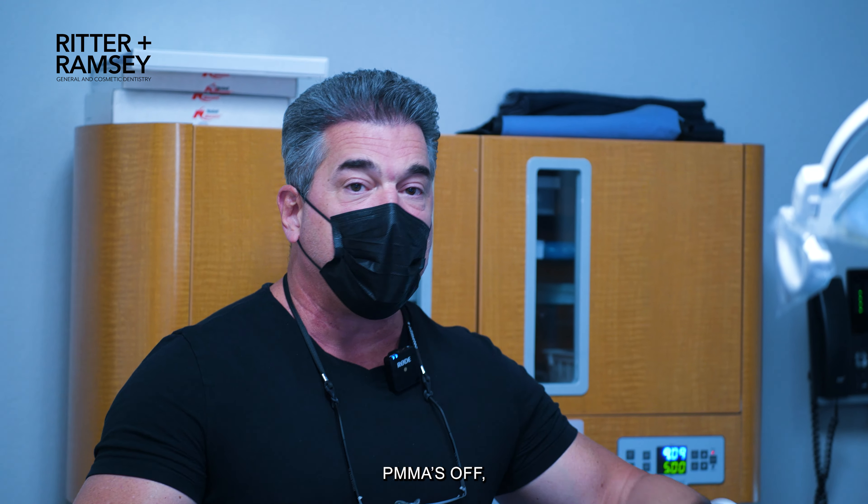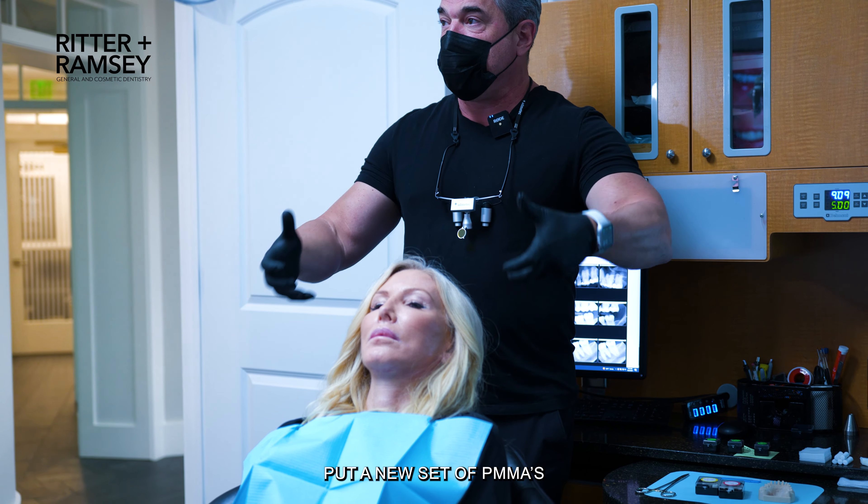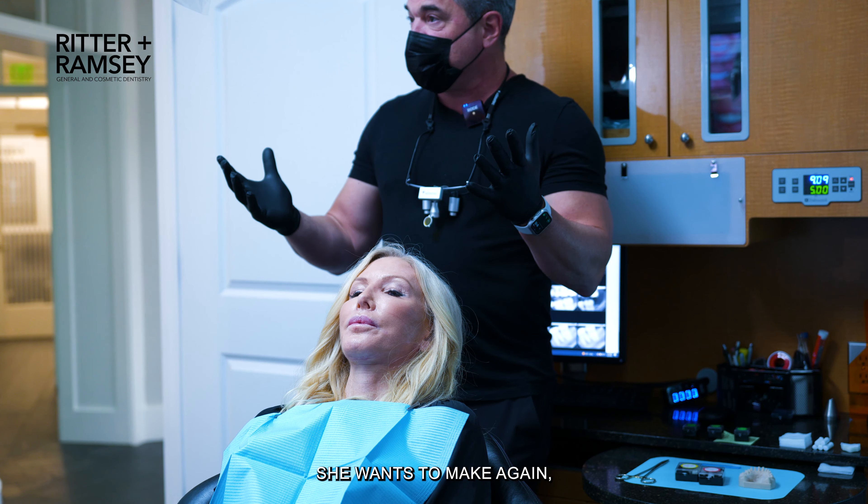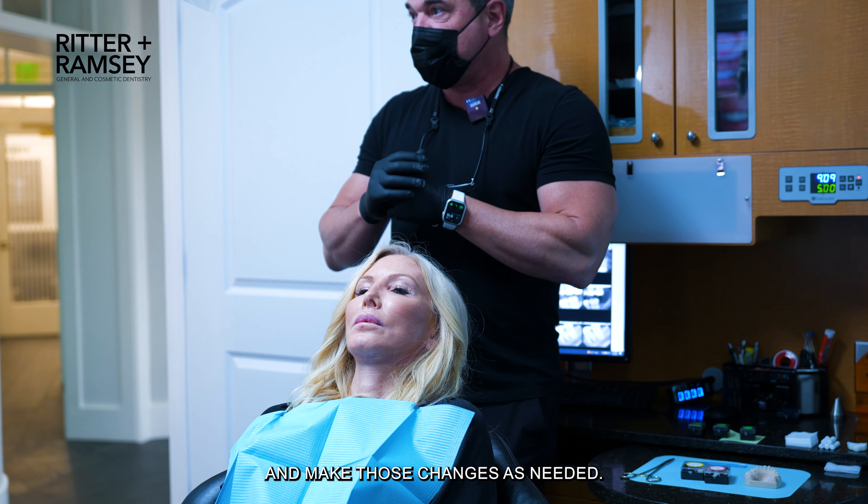So we're about to take one set of PMMAs off and put a new set of PMMAs on that represent some of the changes that she'd like to see. And if there are some changes she wants to make again, we're happy to go ahead and make those changes as needed.